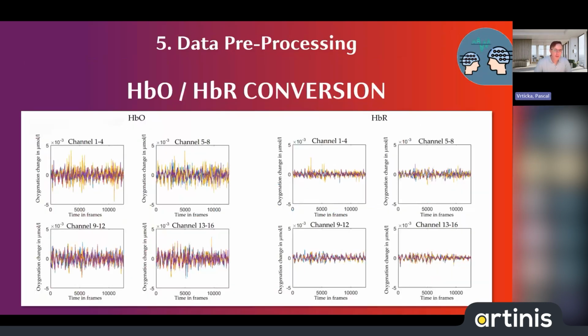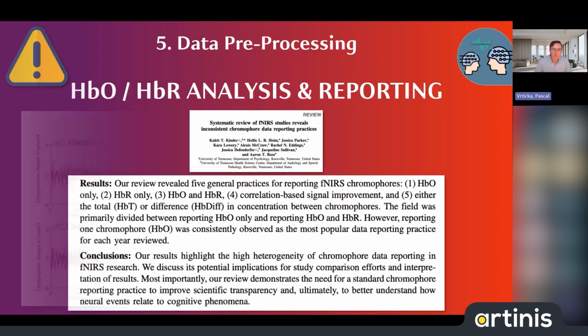What then also needs to be done is to convert the data into HBO and HBR. That's not so interesting by itself, but another consideration that you might remember is whether you are actually reporting both the HBO and the HBR data, or whether you are actually analyzing both the HBO and the HBR data.